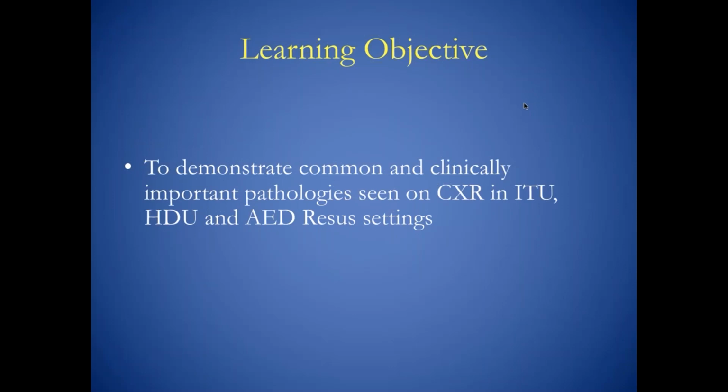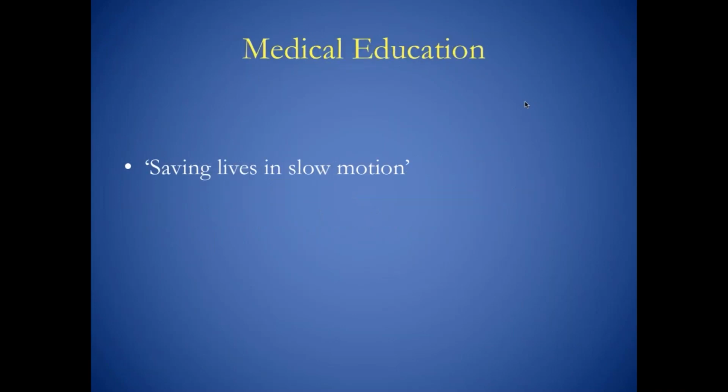My learning objective is to demonstrate common and clinically important pathologies seen on the chest X-ray in ITU, HDU, and in resus settings. You probably all know this, but medical education does save lives in slow motion. And sometimes, as in intensive care or emergency radiology, it can save lives pretty quickly.